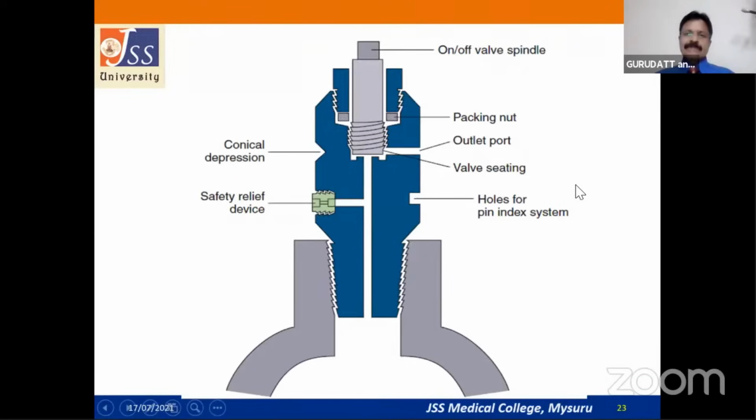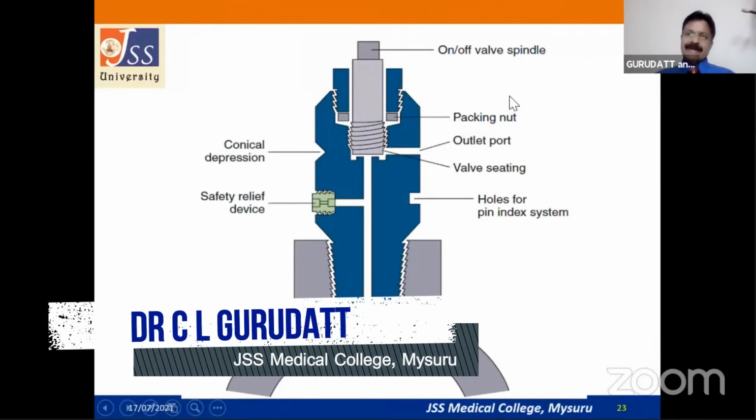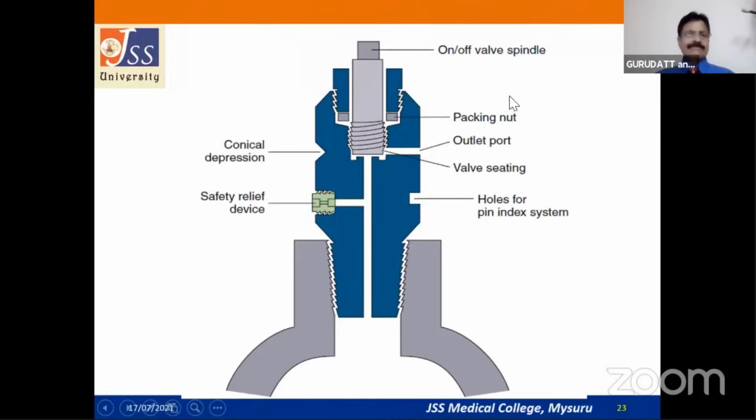Now, sometimes they'll ask you what type of cylinder valves these are. They are called direct cylinder valves, or otherwise pack valves, because a Teflon packing is there, and the spindle is there. Once you rotate the spindle anti-clockwise about 3 or 4 times, this pack will open up the port so that the gas from inside can directly enter the anesthesia machine. So that's why these are called pack type, and also direct acting valves.